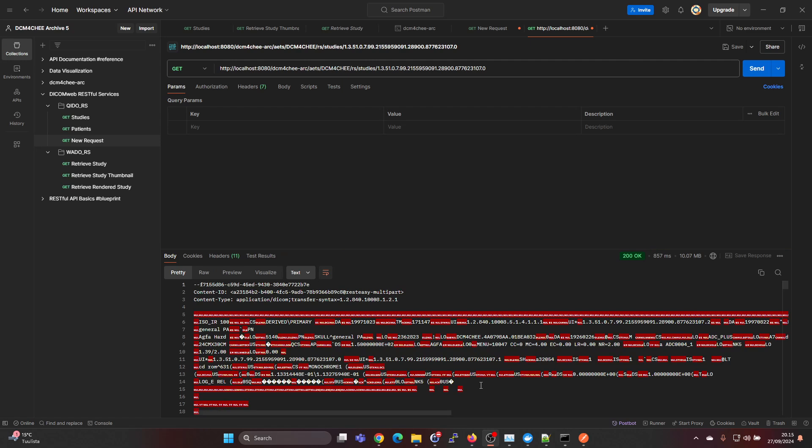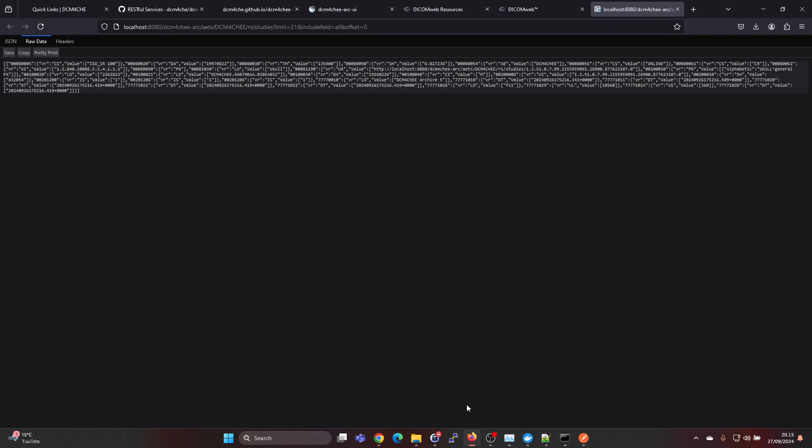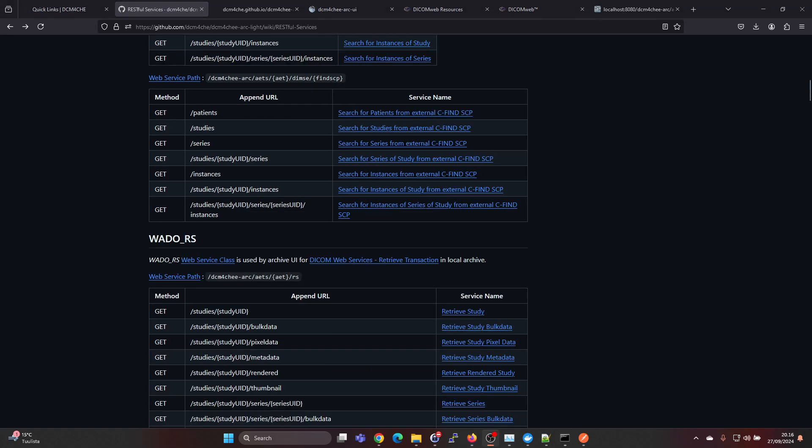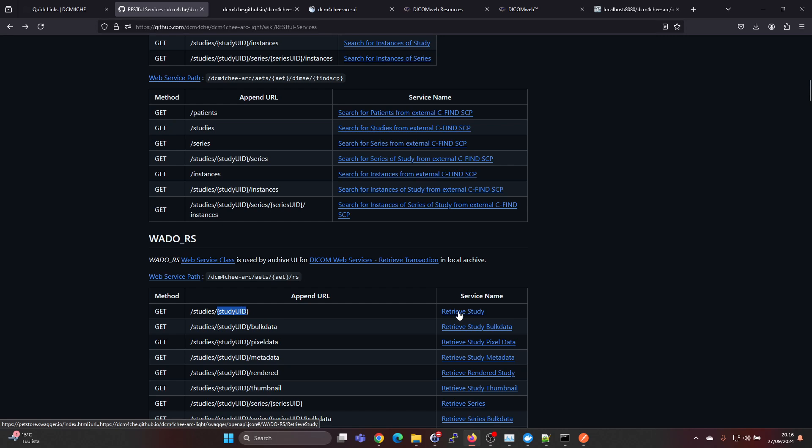To actually better understand what this query does, we can go back to the documentation here. For QidoRS we have a studies query, but then we also have under WadoRS we have studies. When we supply the study UID here, it's actually a retrieve study transaction.